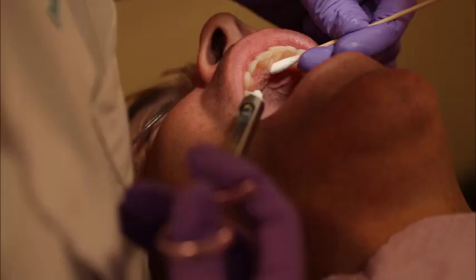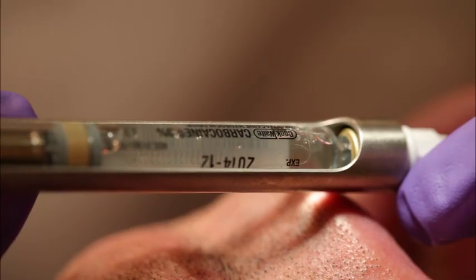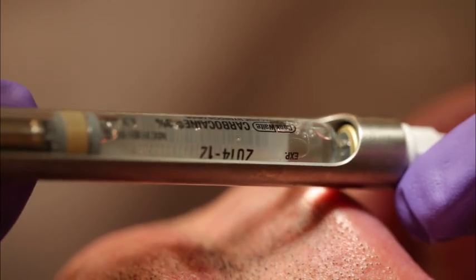Direct the syringe at a 45-degree angle toward the base of the incisive papilla, with the large window facing you. Insert the needle approximately 3 to 6 millimeters into the tissue on the lateral side of the incisive papilla towards yourself until you contact the maxillary bone. Meanwhile, maintain pressure on the contralateral side with the cotton tip applicator. Aspirate by pulling the thumb ring back gently 1 to 2 millimeters at the injection site to prevent the possibility of an intravascular injection.